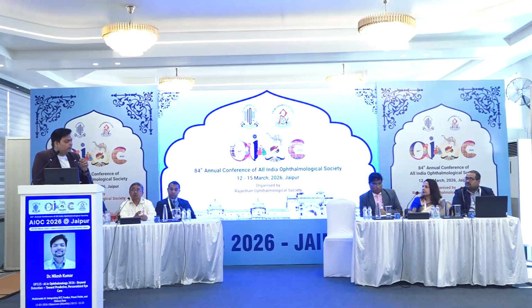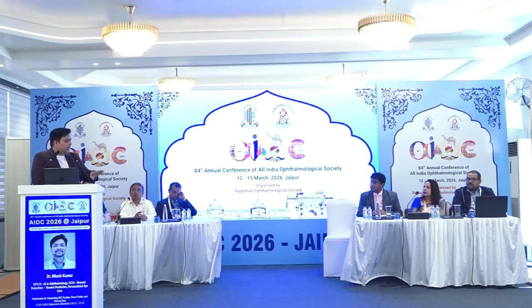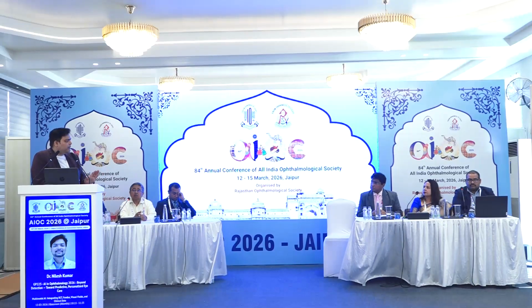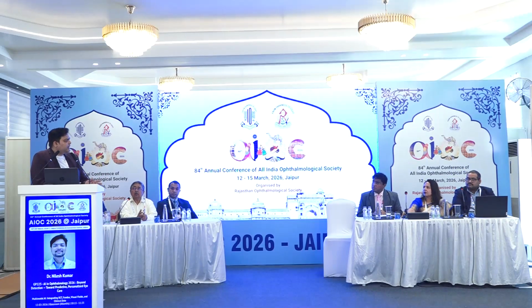Good thing about this, ma'am, I do manual cross-checking, and as I told, it is aiding the diagnosis and not making the diagnosis as such. I take the clinical scenario into the picture, the patient's IOP and the corneal thickness and other factors as well, and if it is the first time, then I still do a repeat follow-up at 6 months, and if it is matching, then only I start the treatment, at least for glaucoma.